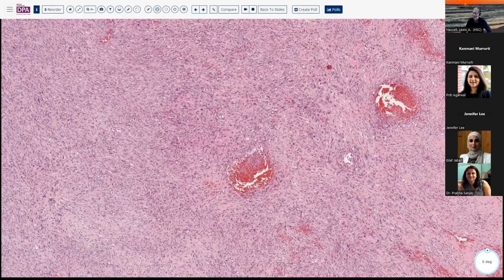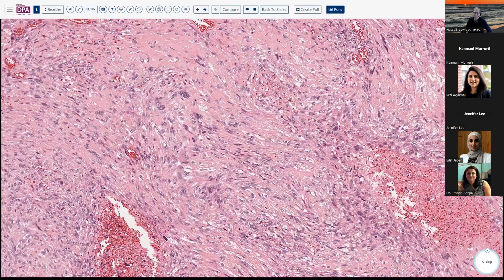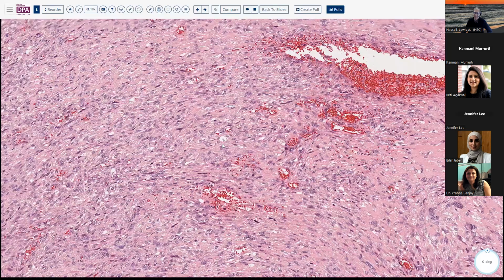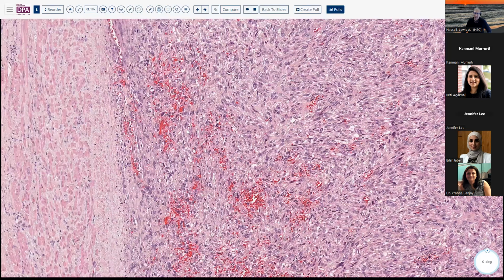Now, having said that, the digital pathology vendors and so forth are moving with reasonable speed to allow the manipulation of their images in various ways to compensate for that difficulty. So either the polarization microscopy or other methods that can be adapted to digital slides to derive similar information have been employed.